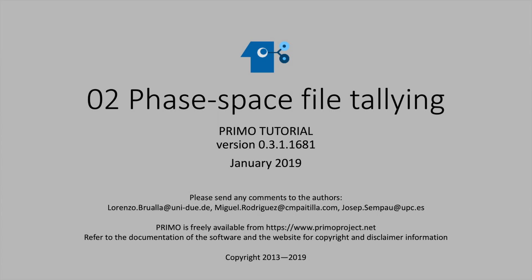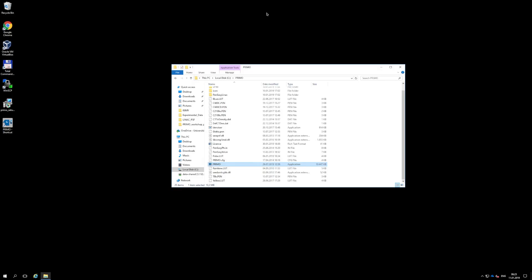We are going to tally a phase space file at the exit of the patient-independent part of the Linac, that is, just upstream of the jaws. The patient-independent part of the Linac is called Segment 1 in Primo.